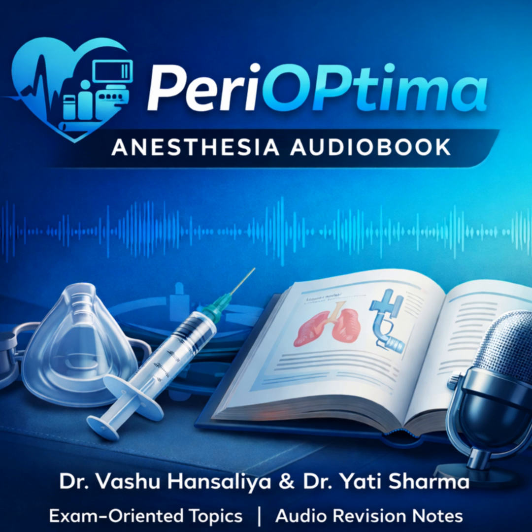When everything else has failed, the LMA still has this incredibly impressive success rate. It's cited consistently between 95 and 99%. That number alone justifies its inclusion on every difficult airway trolley in the world. Wow. When you answer an exam question on this, you have to articulate that rescue role eloquently. SGADs prevent hypoxic brain injury. That's the ultimate disaster. They buy the clinician critical time to call for help, time to adjust their technique, or time to prepare for a surgical airway. They transform a crisis into a manageable sequence.